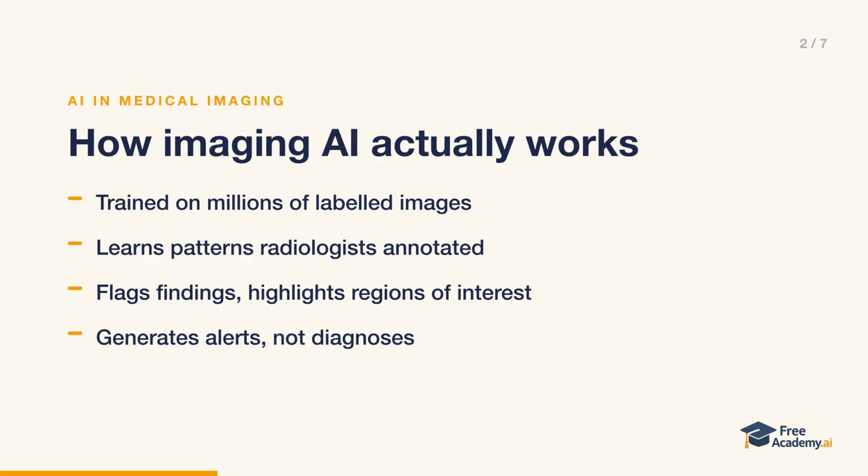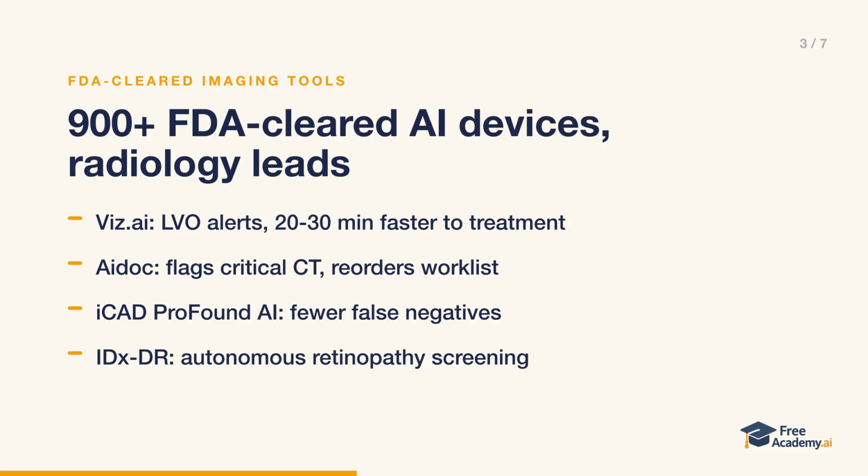Notice the wording carefully. These tools do not make a diagnosis. They generate alerts and highlight regions of interest for the radiologist to review. The interpretation and the decision that follows it stays with the clinician. As of 2025, the FDA has cleared over 900 AI-enabled medical devices, and radiology is the largest category.